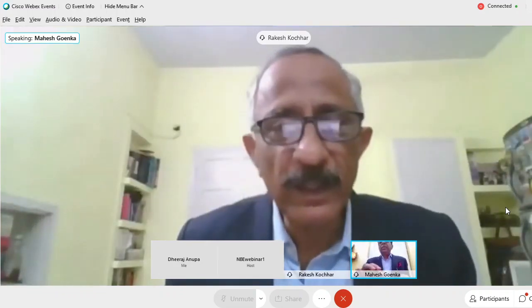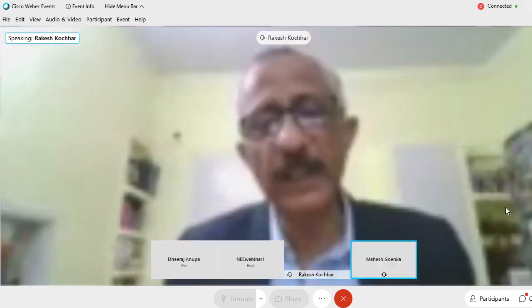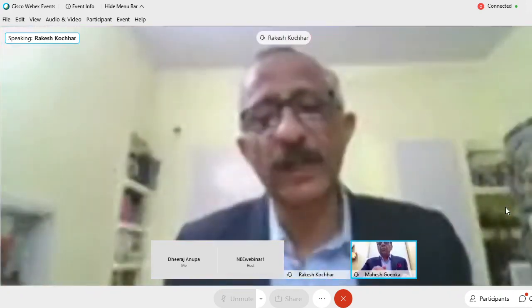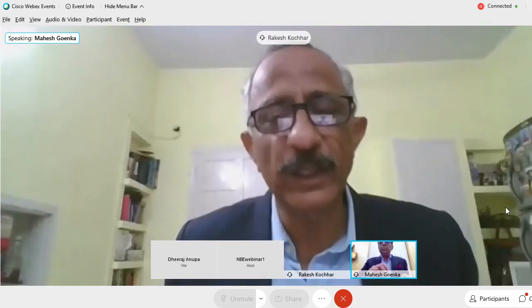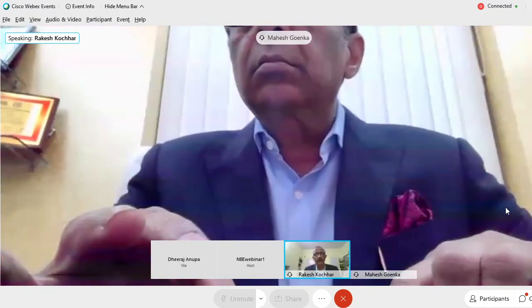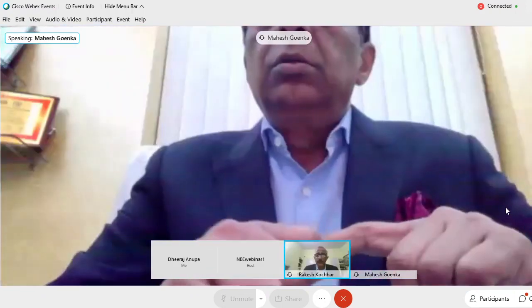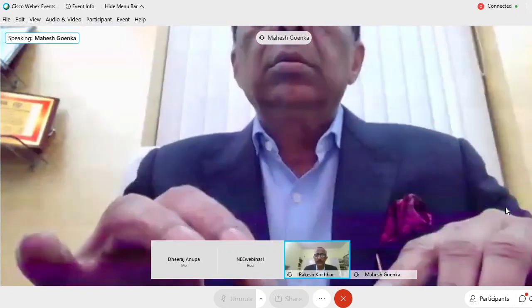You also said that retroversion can also help us in the differential diagnosis. Yes. Retroversion will show you the laxity of the diaphragmatic crus. So that is a part of the examination of the hiatus hernia. Can we differentiate D2 and D3 endoscopically?